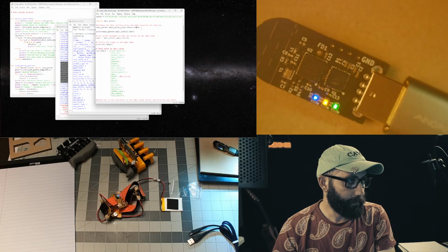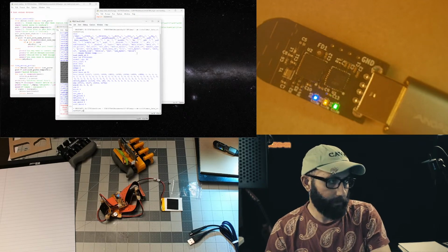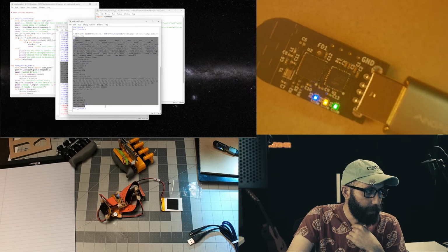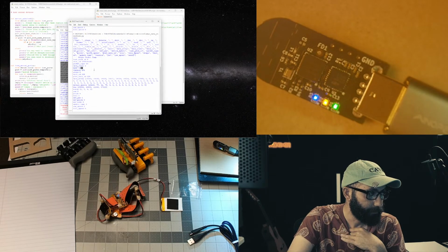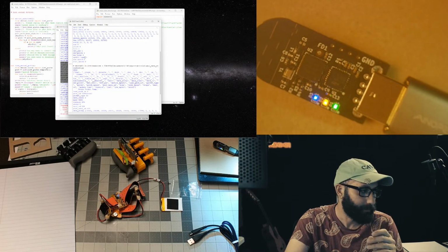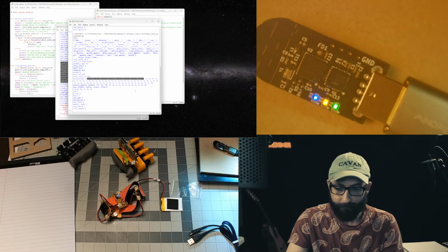And instead of data, we're going to use data with two T's here. And this should parse the data. Okay, good. So now we entered in a new packet, and you can see that it has different values. The battery is at 3880. Before it was at 3850, so it must be slightly more charged. And we do have different values for the data array here.